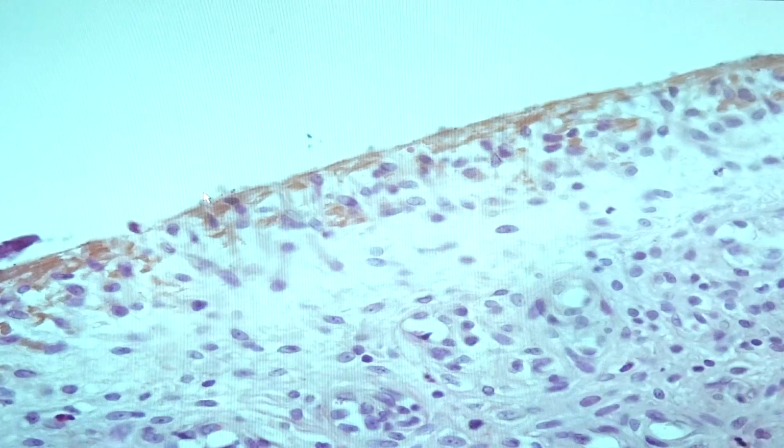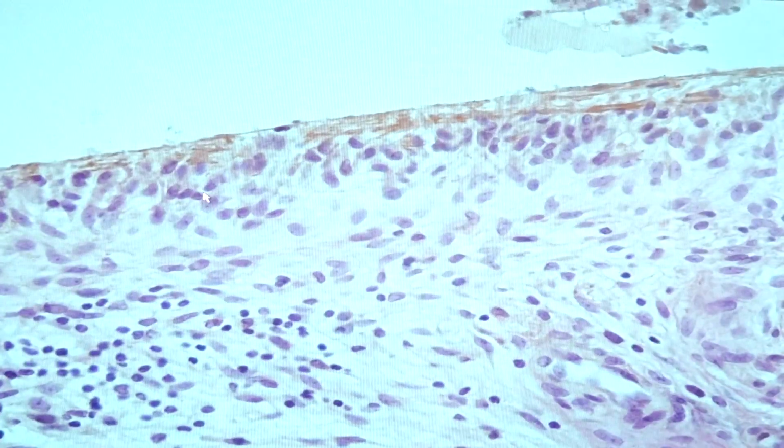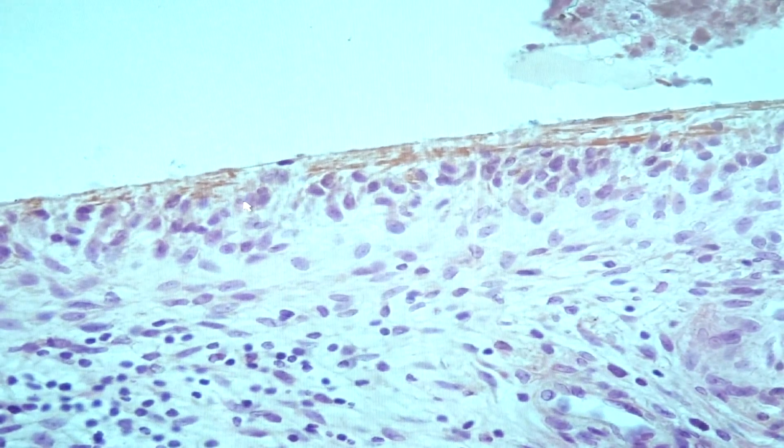Here, this would be the synovial area, this portion. So you can see the synovium. Usually the synovium is only a single layer. You can see the presence of the synovial cells, similar to the mesothelial cells. But in this case, you would see some synovial cells increased in number.